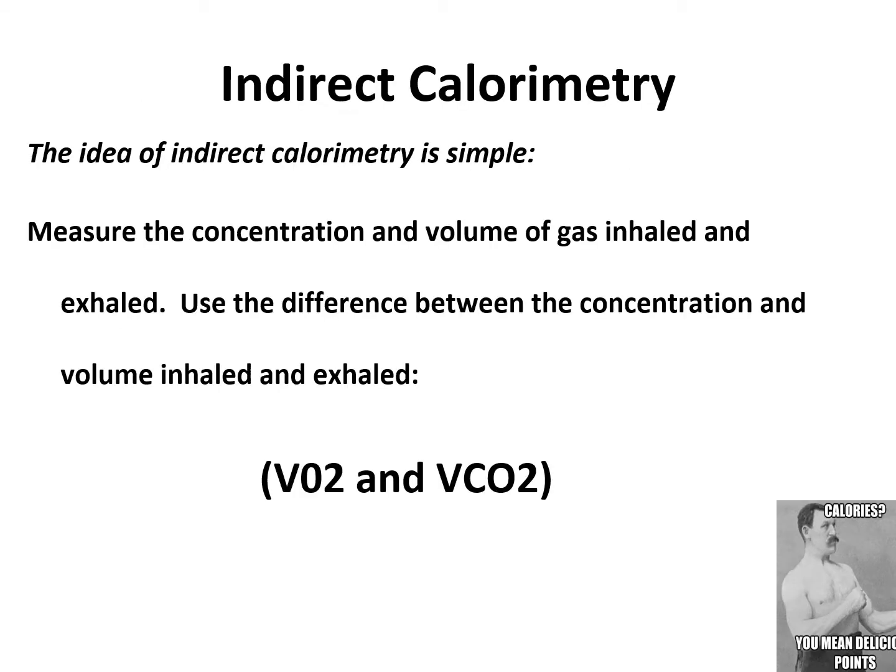As you'll be seeing in the coming slides, indirect calorimetry allows a clinician to estimate energy expenditure from these measurements of oxygen consumption and carbon dioxide production.